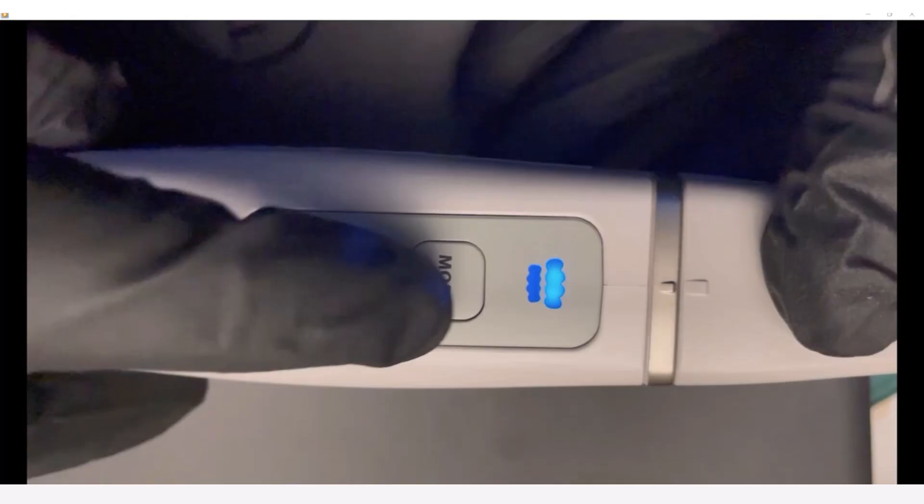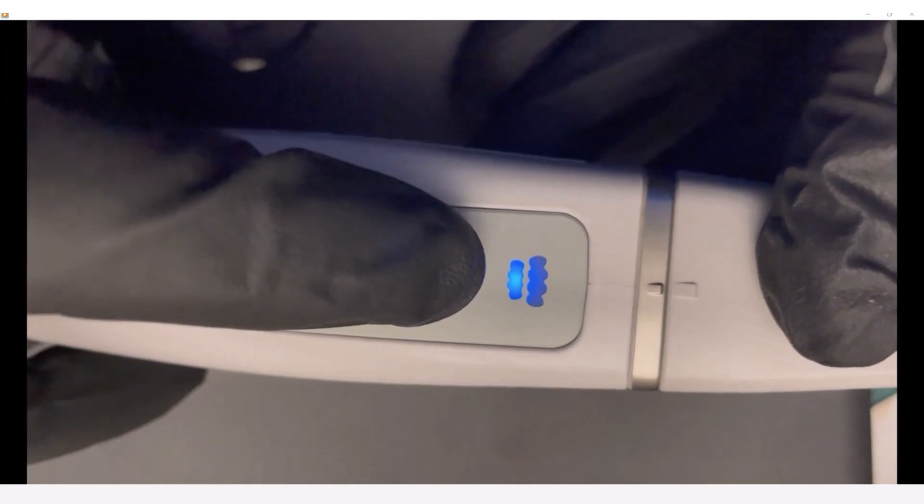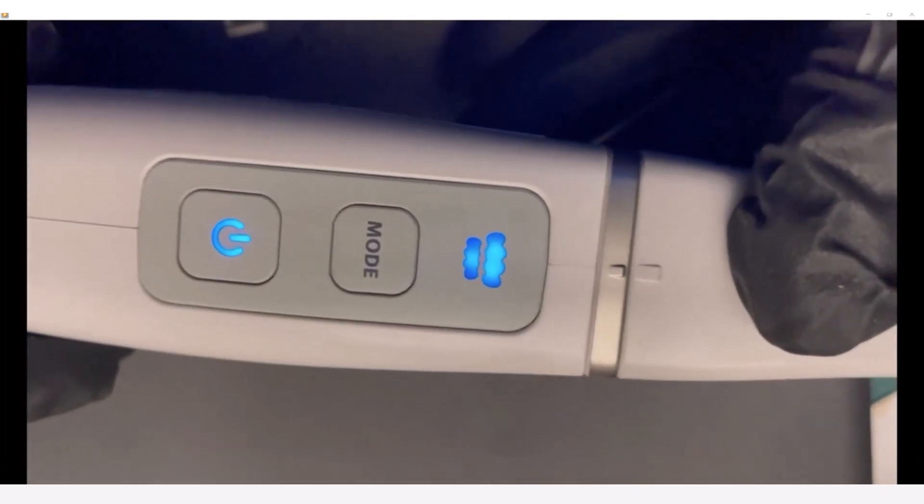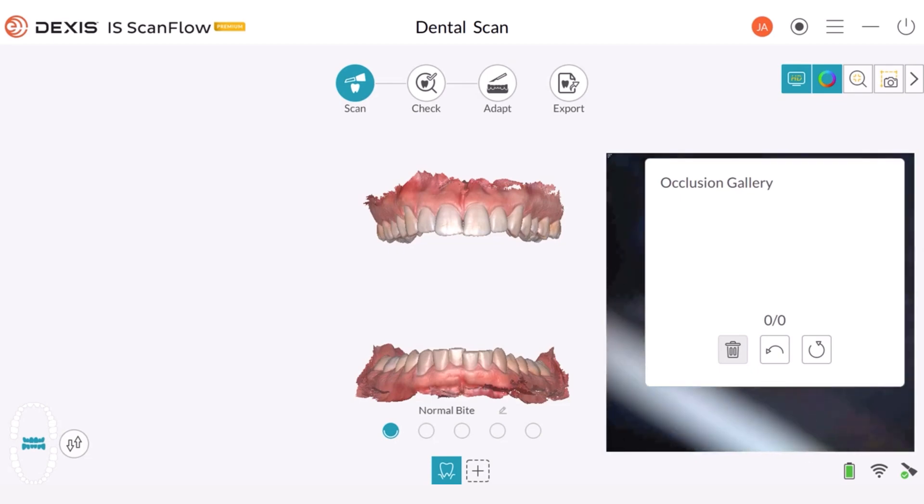Next, take your scanner and press the Mode button. Once it is activated, the indicator lights will turn on, signifying that both arches are selected and that we are ready to take a bite registration.